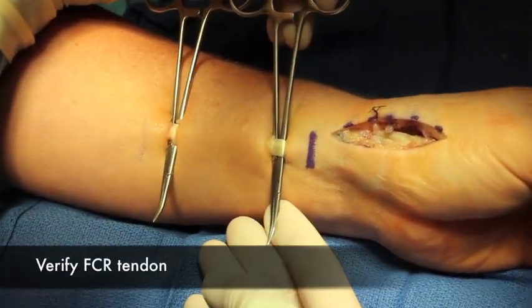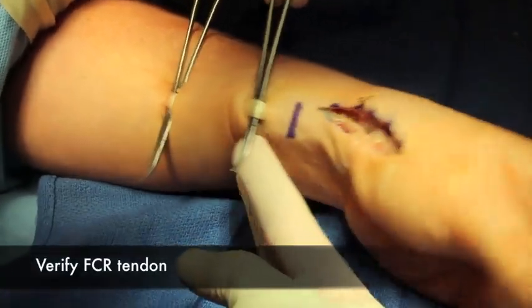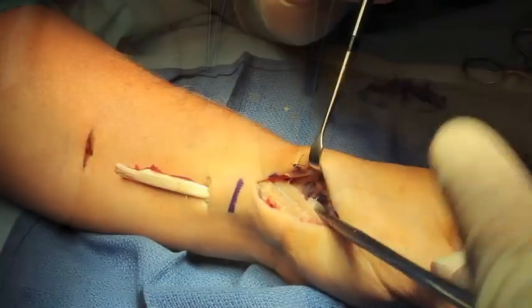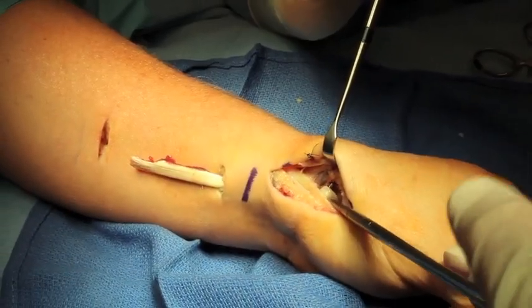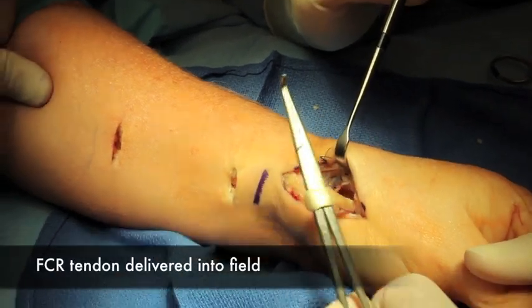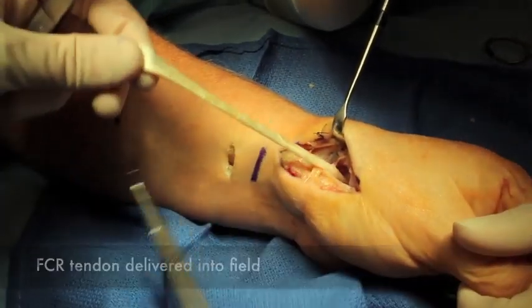The FCR is identified, incised and freed up, and it's delivered through the wound and into the base of the thumb for ligament reconstruction.